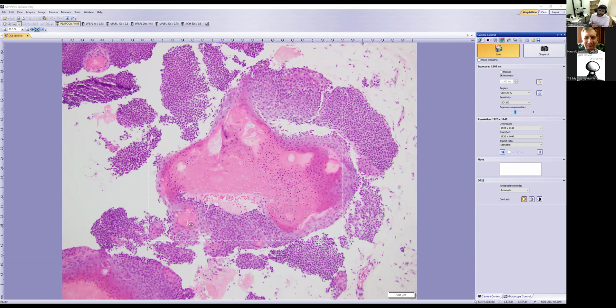So based on the resection specimen, we were able to confirm that this is actually an adnexal tumor, not a metaplastic carcinoma of the breast. The pseudo-infiltrative pattern, which I showed you on the biopsy, was appreciated better in the resection specimen, and it was not actual infiltration, but a pseudo-infiltration pattern.